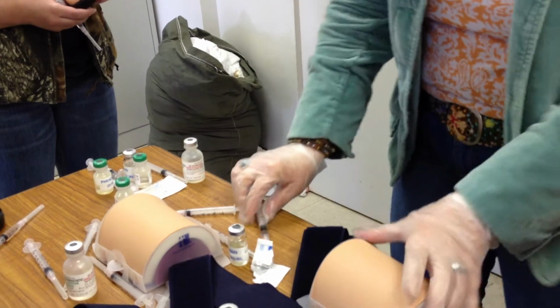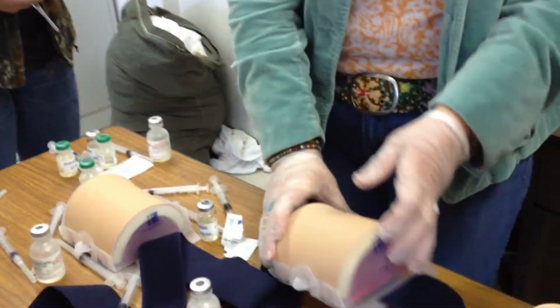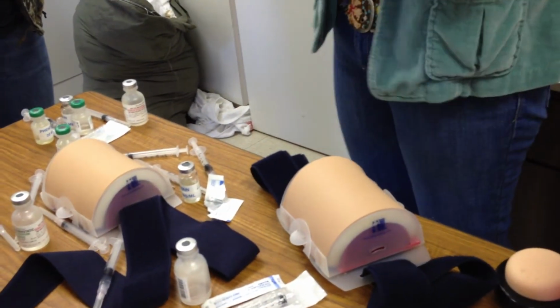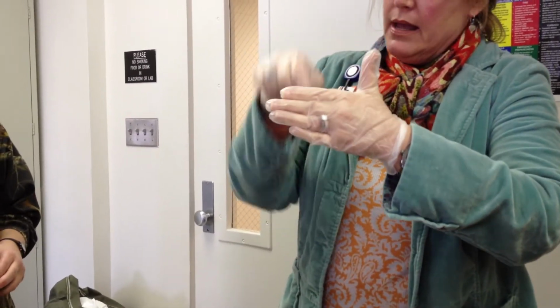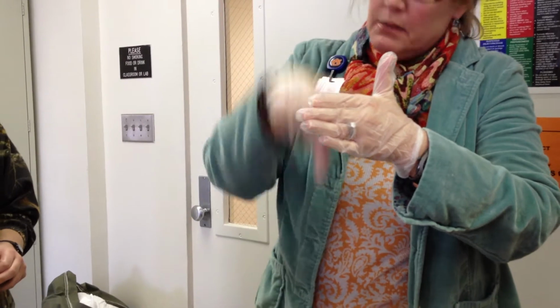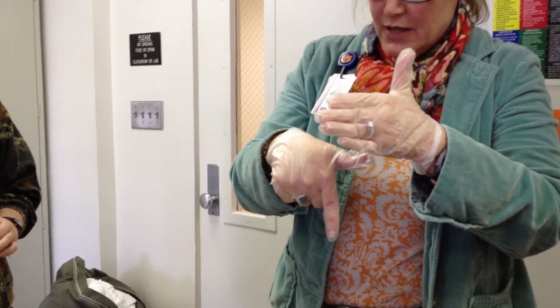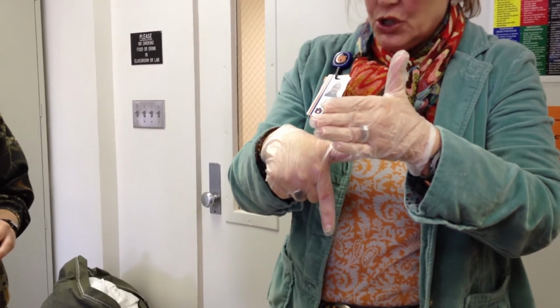We're ready to go. Now, on this patient, I've decided this is a deltoid. Let's just say, okay? My non-dominant hand is my left. And when you go in this step for IM, it requires that you displace the skin over the injection site, simply because you move it out of the way, then you puncture and put the medicine down into the muscle. You make sure that it's not in a vessel by the aspiration step, which I'm going to show you what that is.